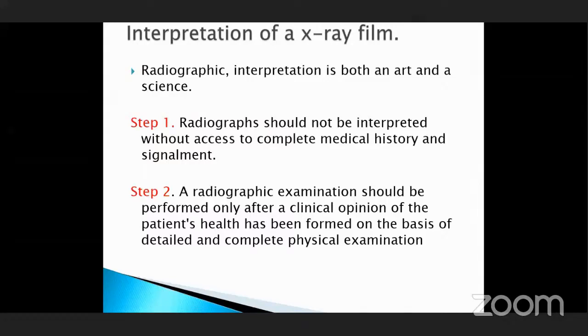Now, many other steps must be followed before giving your diagnosis. That radiograph should never be interpreted without access to complete medical history and signalement. You must know about the clinical signs, the duration of clinical signs, any improvement, as well as the signalement. Signalement is very important. You must know the age, weight, breed, or sex of the patient.